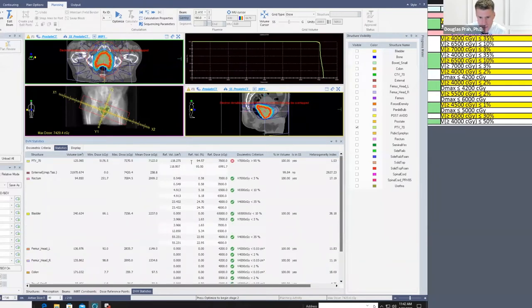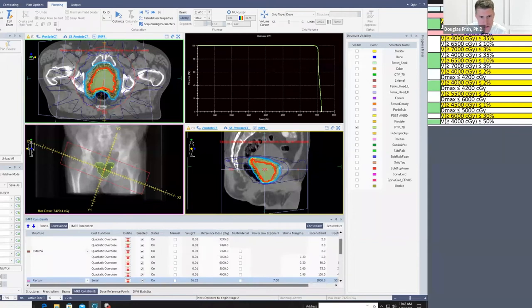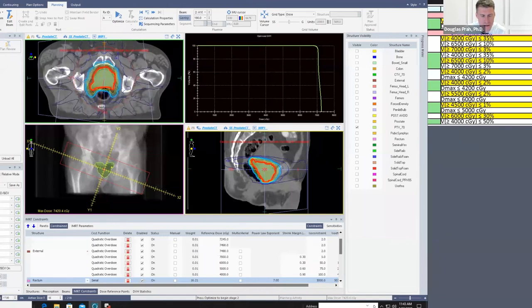This is, again, a partial volume on the corner. It is always best when looking at these to realize that in stage one, if your plan does not look very good, you're going to have some problems because stage two is never going to come together. So let's kick this to stage two.